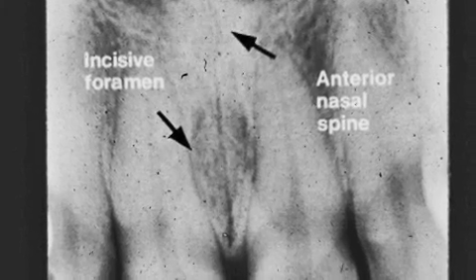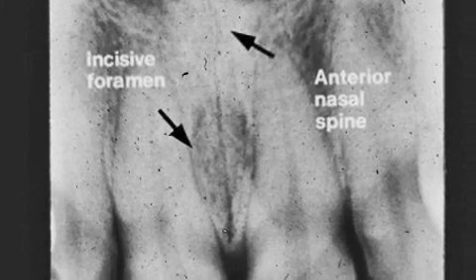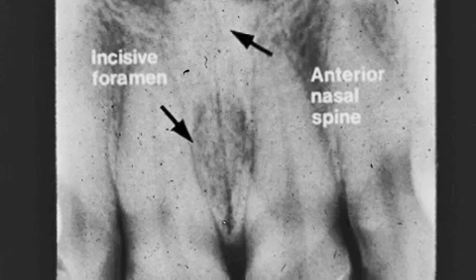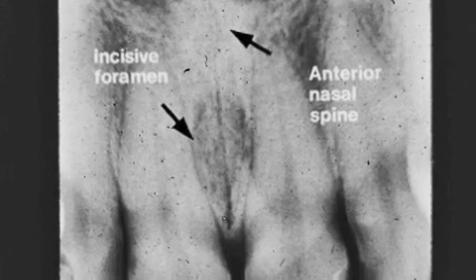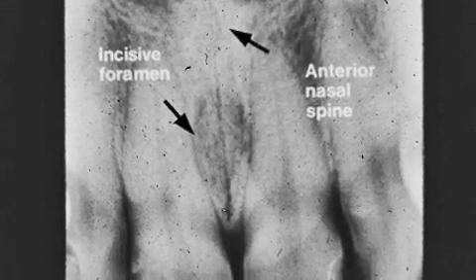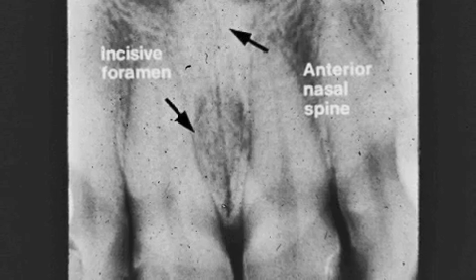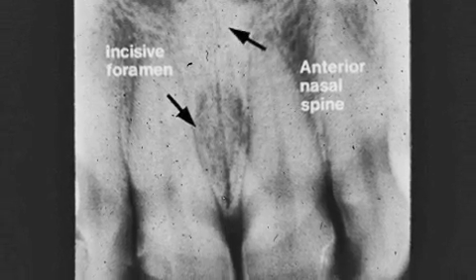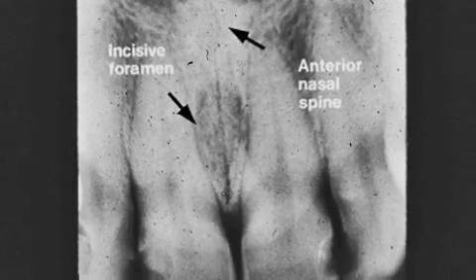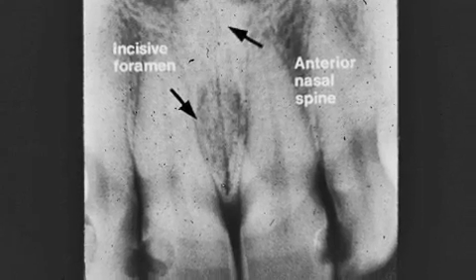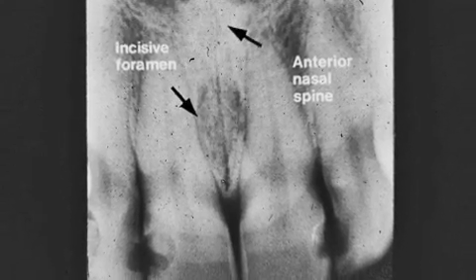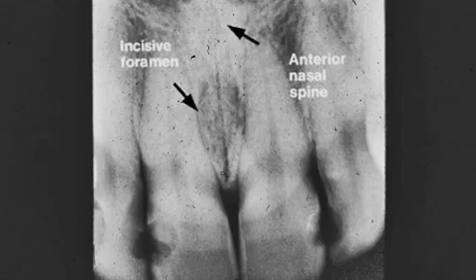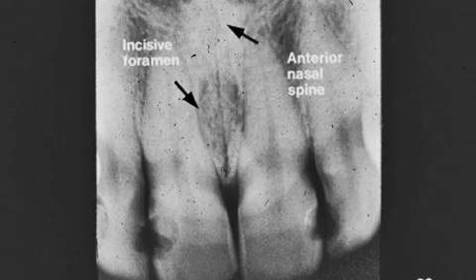The arrow to your left points to the radiolucent oval, which is the incisive or palatine foramen. The arrow above that is the anterior nasal spine. It is radiopaque and is diamond-shaped, or like the back of a bat or a turtle.